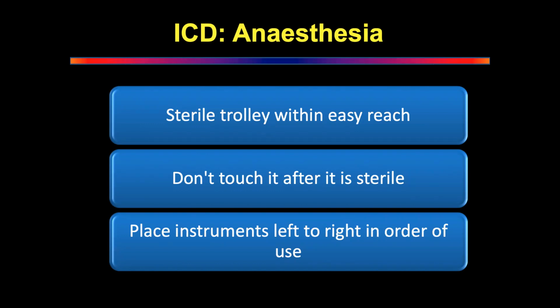And then what do you do? Wait for the local anesthetic to act. That is a common mistake which all junior doctors make. They give the local and they reach for the blade. So you have to say in the exam, I will give the local anesthetic and I will wait for about 10 minutes, or 5 minutes or 7. I don't care what time you wait. You have to wait and check whether the anesthesia has acted or not.